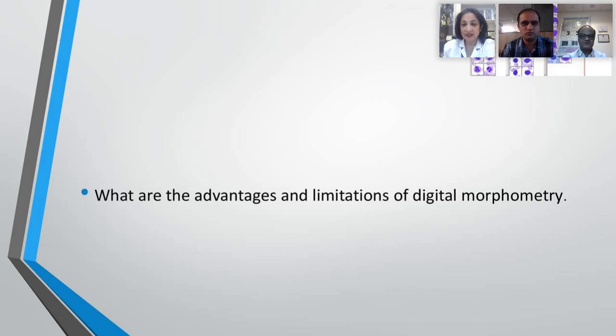I agree with you on this. I think the way forward is to club the cytomorphometry given by the analyzers with the digital morphometry, looking into the flags over there and the cells over here, combining it in a very short time and reporting out as soon as possible, giving critical alerts. That is the biggest advantage that I feel we will have with digital things coming up, and that we are actually practicing now. Correct. You're right.